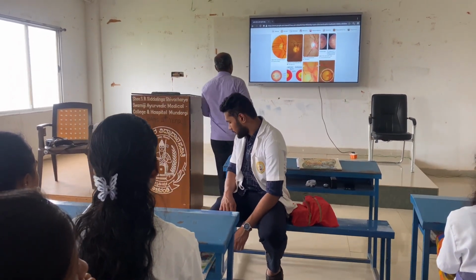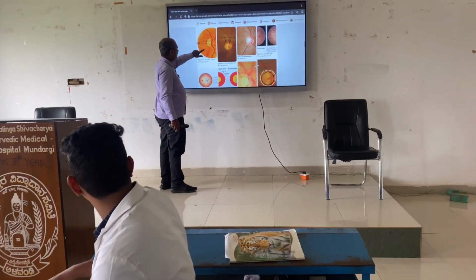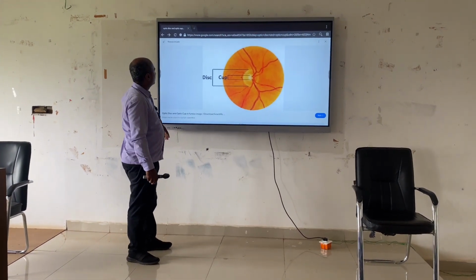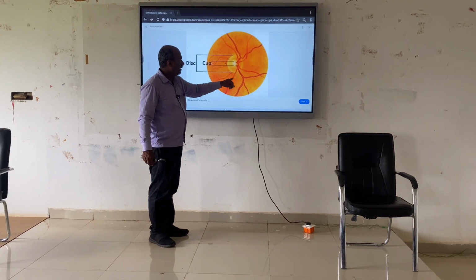इसमें ये आर्टरी है कि ये वेन है, कि कौन सा कौन, ये आर्टरी है, ये आर्टरी है, कौन सा बोल सकते हैं? हाँ, इधर दिख रहा है ना, ये कौन सा है, ये आर्टरी है या ये आर्टरी है?